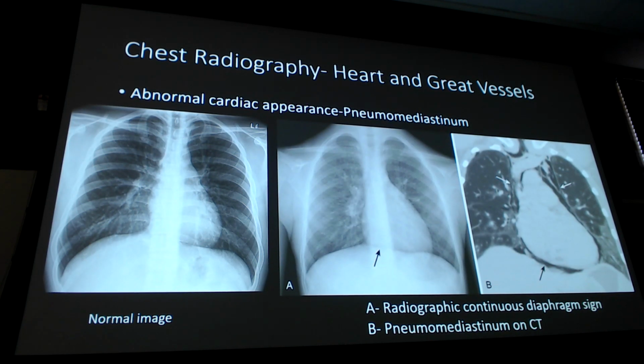We're going to talk about another condition called pneumopericardium, which is almost the exact same thing as pneumomediastinum. The difference is one has air just in the pericardium, and one has air above the heart into the great vessels. Once it goes up into the great vessels area, like here on this CT, that's where we have a pneumomediastinum, because now it's including more than just the pericardium. And that's kind of my cutoff when I'm looking at things.